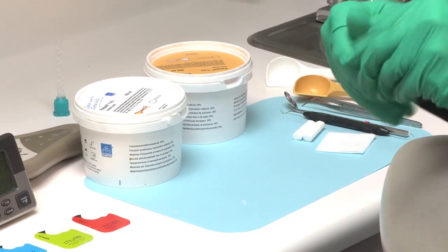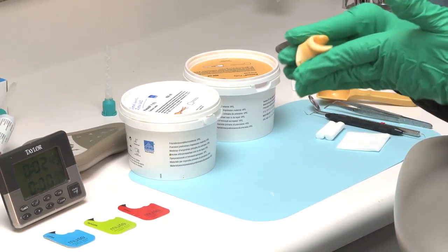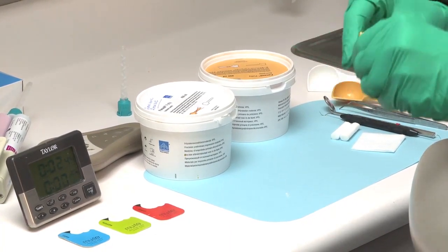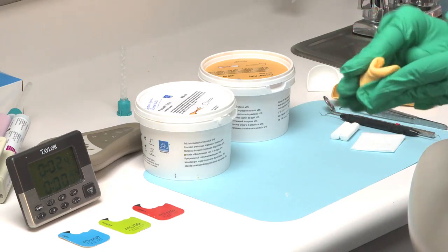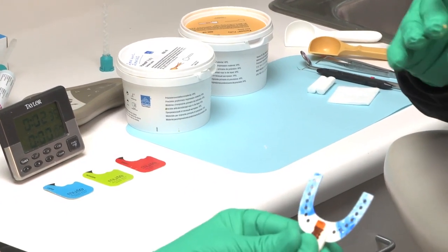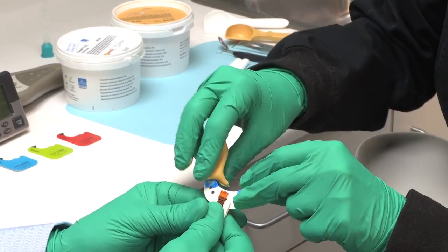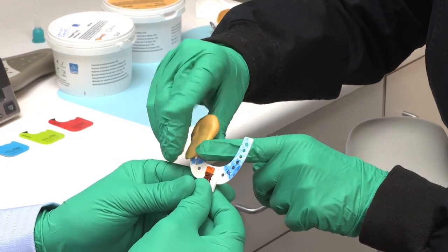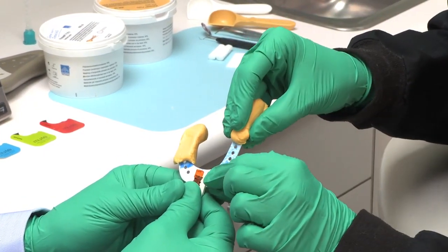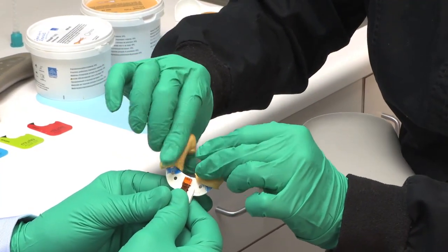And I think we've all been to a state fair and had a corn dog. So Tammy is going to make us actually 2 corn dog pieces, and the putty will be the corn dog, and each side will be like the skewer of a corn dog. And you'll see how she places the putty over the bite fork. She's skewering it. And building it up. And like I said, this is why I like the putty over a mousse type bite registration material.